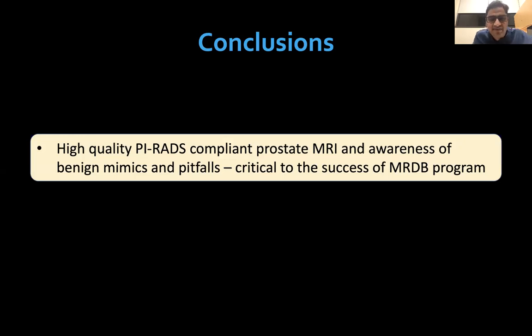So that's the end of the presentation. A whirlwind tour of the prostate MRI, and I hope you all got something out of this. It's important to recognize that high-quality PI-RADS compliant prostate MRI and awareness of the benign mimics and pitfalls is critical to the success of the MR-directed biopsy program. Whoever is reading these prostate MRIs needs to collaborate with the urologists and provide high-quality patient care.